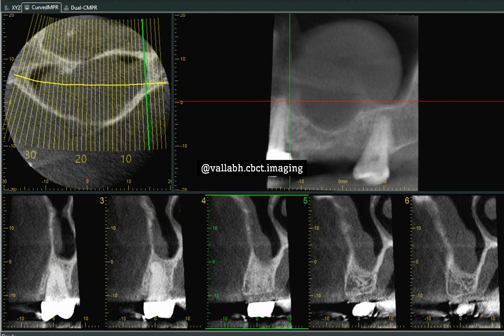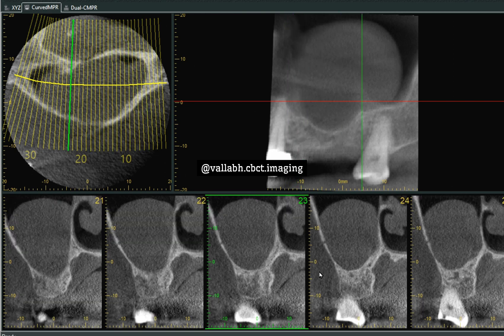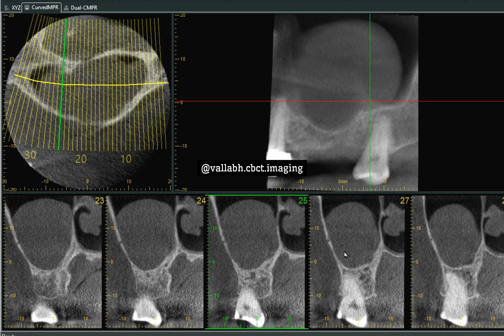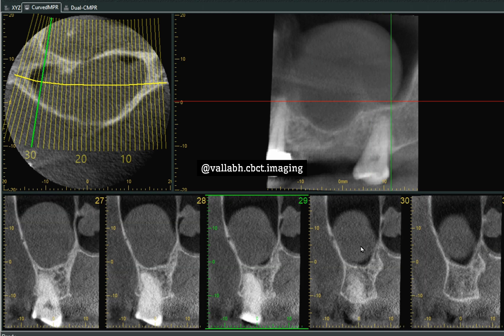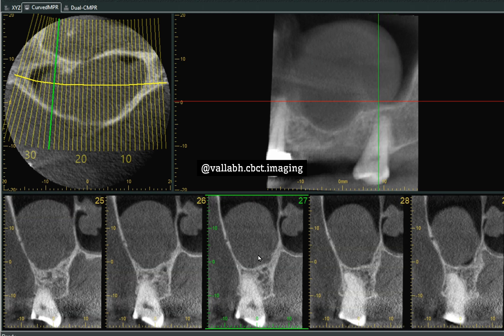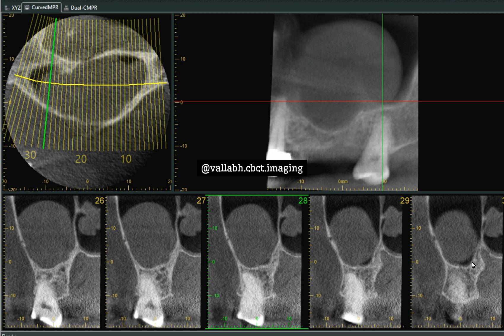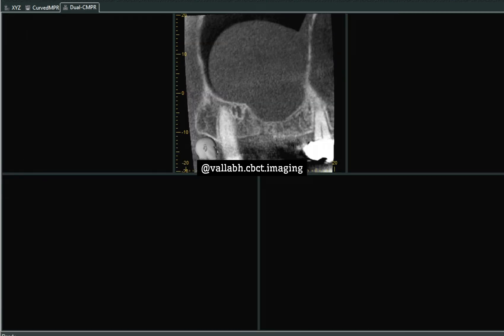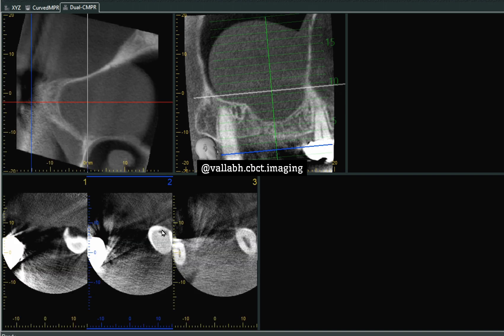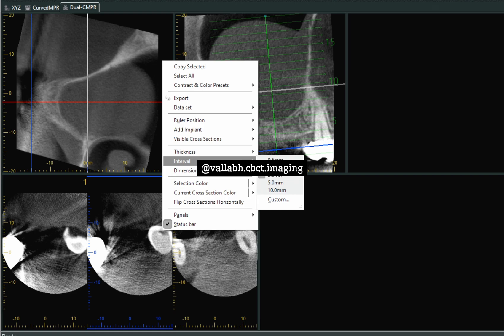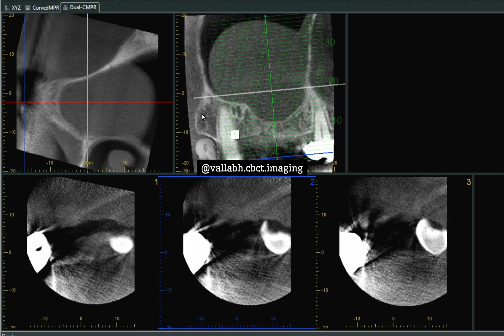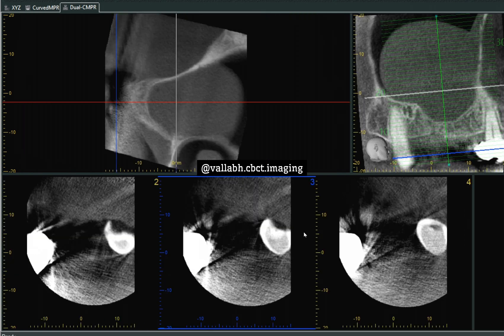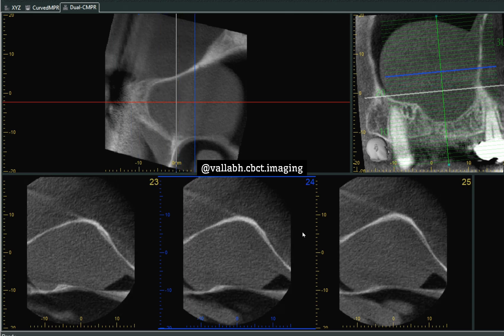In the CMPR view, where we have sliced the teeth into the smallest cross sections at 1 mm cross sections, you can see it is attached to the medial and the lateral wall and slightly detached from the floor of the sinus. In the sagittal CMPR view, divided into smallest cross sections with 2 mm interval lines, and studied at 1 mm interval lines, this is how it appears in the axial cross section.